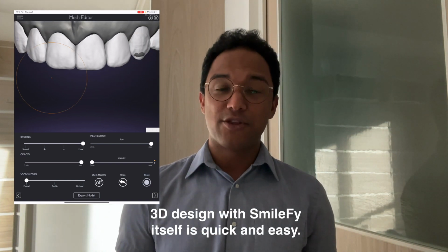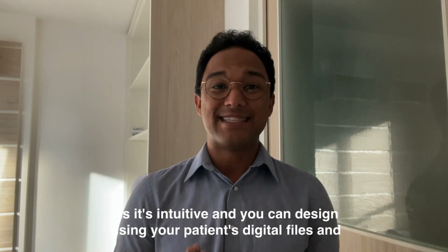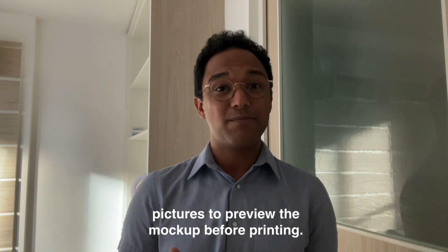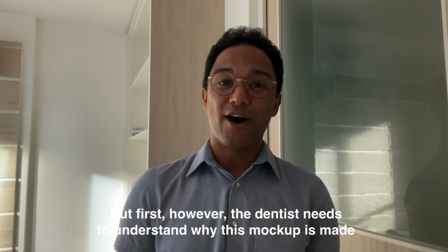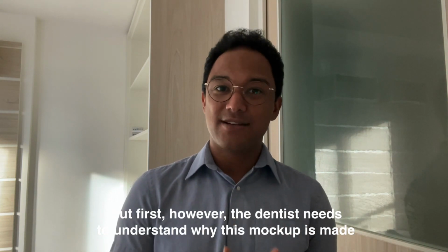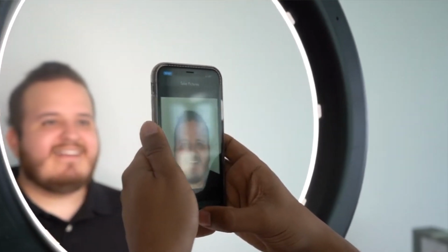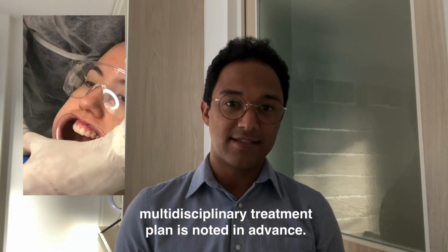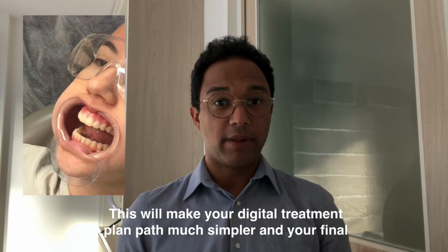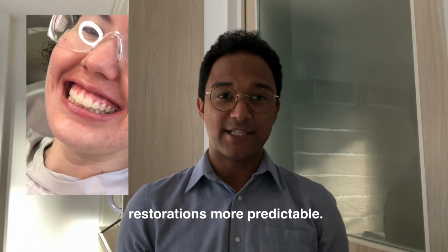The 3D design with SmileFy itself is quick and easy, as it's intuitive, and you can design using your patient's digital files and pictures to preview the mockup before printing. But first, however, the dentist needs to understand why the mockup is made and when to apply the mockup in the treatment plan. So when performing a 3D design mock-up, make sure that your multidisciplinary treatment plan is noted in advance. This will make your digital treatment plan path much simpler and your final restorations more predictable.